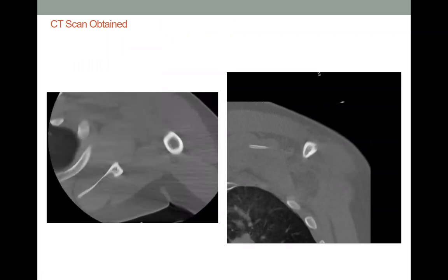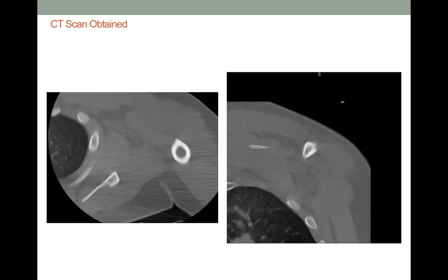So it took a while to get the head back into the glenohumeral joint. The lesser was almost completely encased in callus there, but we were able to get the head back into the glenohumeral joint. We had to rotate the head by putting a K wire in it to get fixation. We also had to do a greater tuberosity osteotomy in order to be able to get back there. So there was an abundant amount of callus already there.